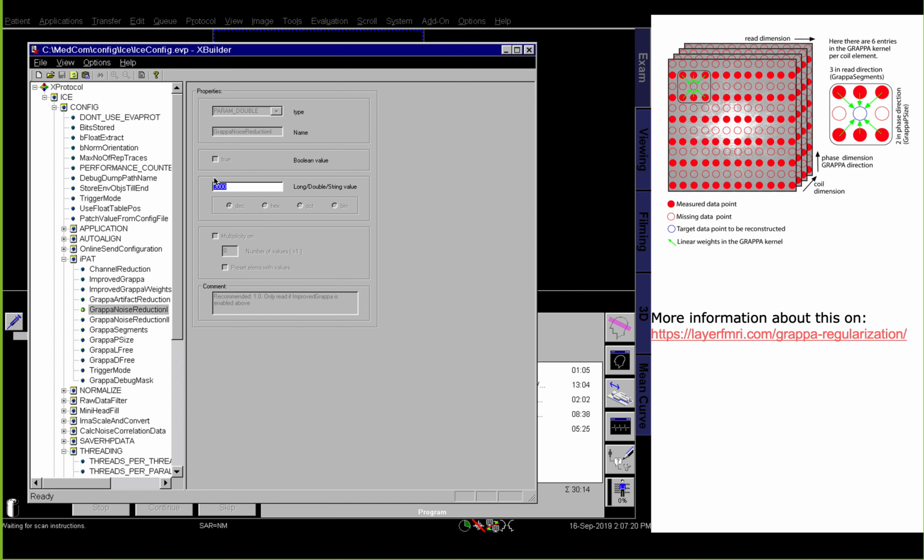for those two different cases, you use very different sequences, right? For fMRI, you use EPI sequences. For liver imaging, you use maybe FLASH or whatever. So if we change the sequences for different acquisition parameters, why shouldn't we also change the reconstruction parameters? So this is basically what we are doing here, and we are trying to optimize the reconstruction based on the specific setups that we have.